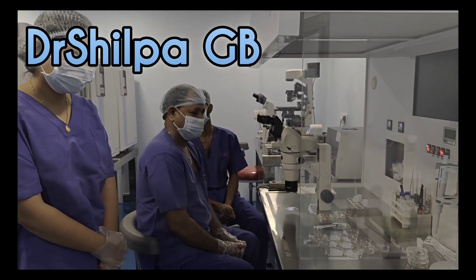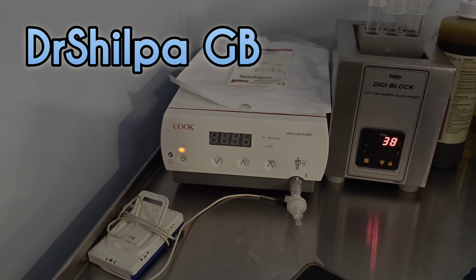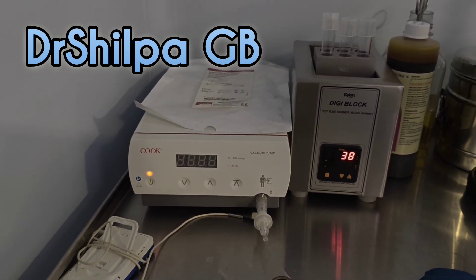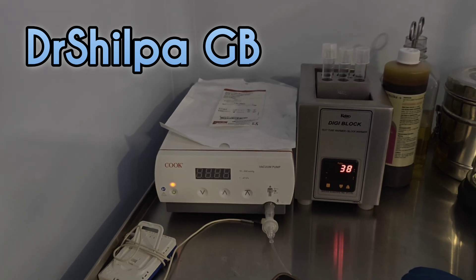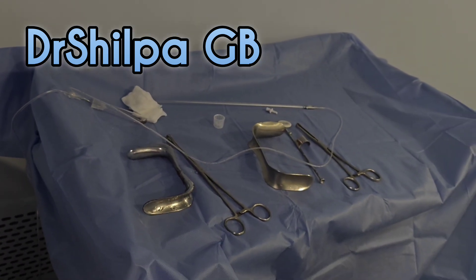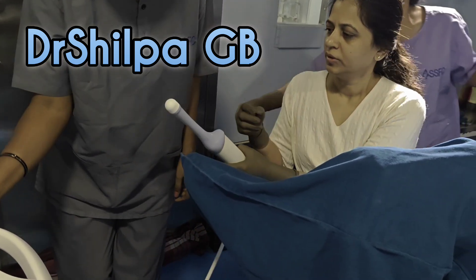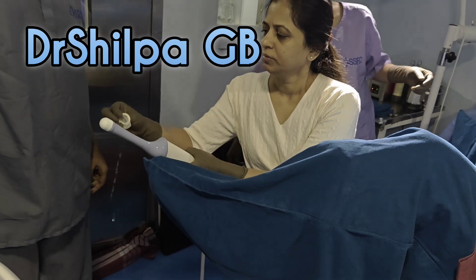We have a team of embryologists who prepare everything. This is the suction pump which is used to create vacuum to aspirate the follicles. This is the tray which is used to clean and help in the procedure.